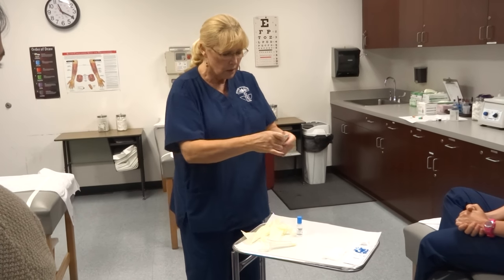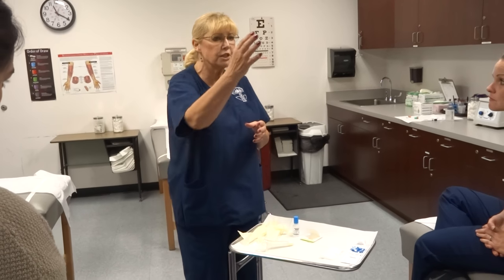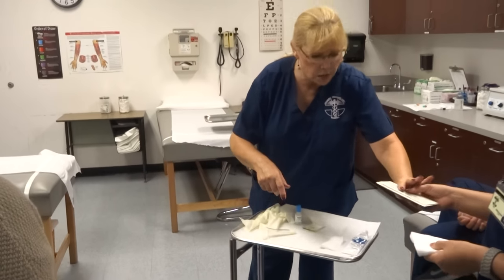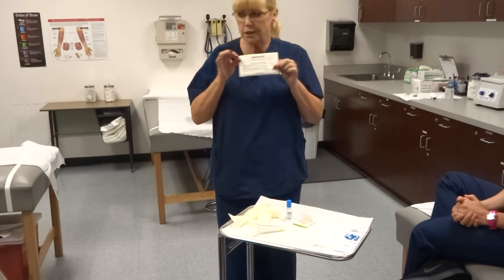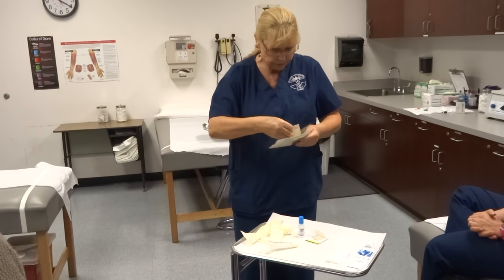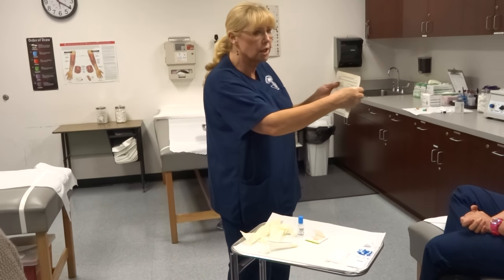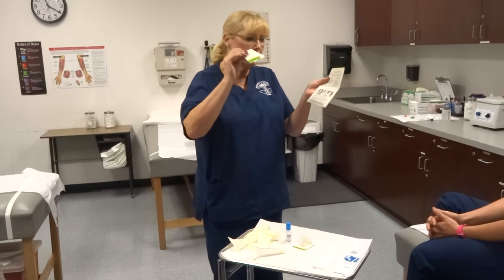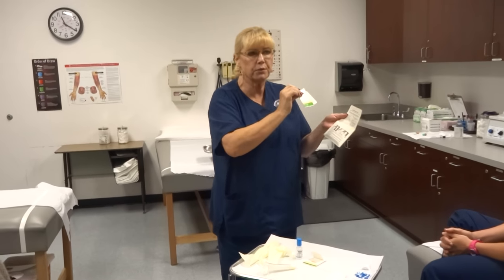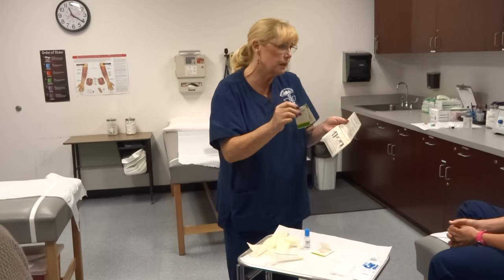He would put the stool sample on window A and B and hand it to you. Then you would turn it around, open it up and develop it. Why does it have to be two? Because they like to see a sampling from different areas. Obviously you're not going to get that if you've just done a rectal exam. Behind you on the table there's a package — an envelope. If this comes up positive for your patient, he may send a pack like this home. There are three of these inside, and you're going to verbally talk the patient through the instructions. You take the stool specimen from one place and put it in window A, then take a specimen from another section and put it in window B — that's why they have the two windows.